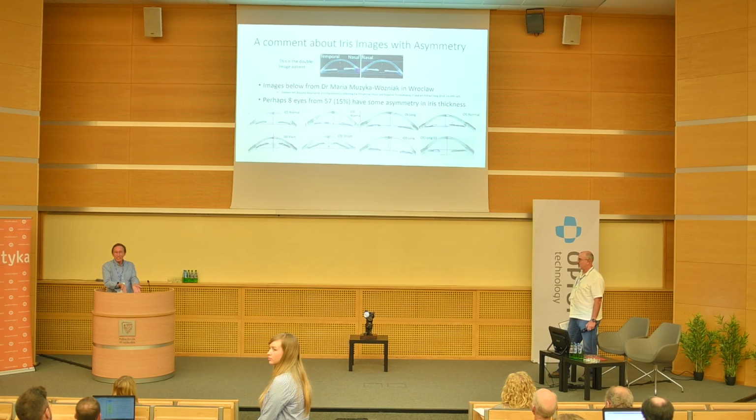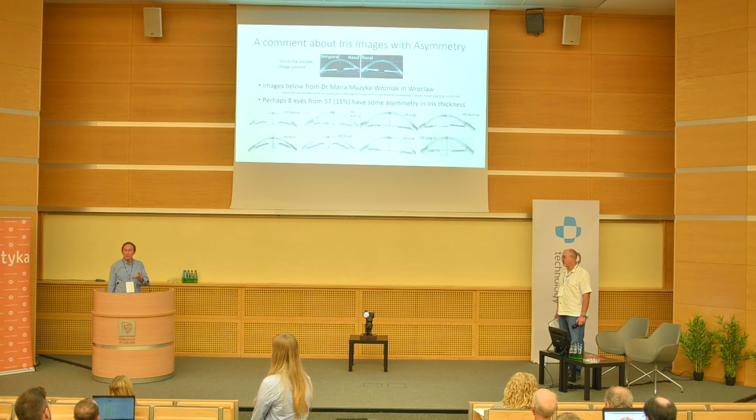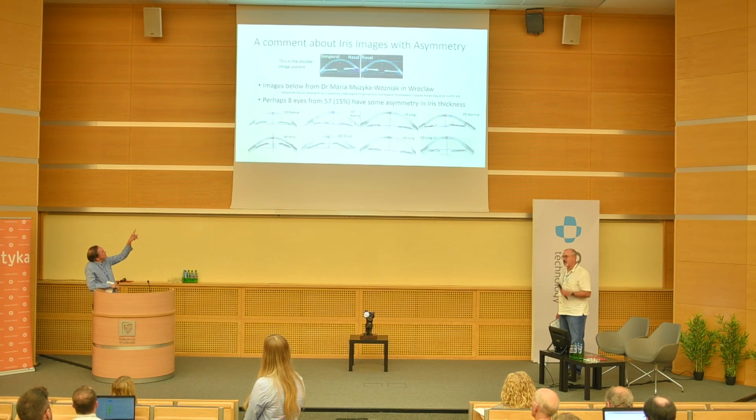I just happen to have these other images that are generally much larger pupils, and you can kind of see it. It just seems like it would be a parameter to track, in case it's indicative of something else. It costs you nothing, in principle. And what do you mean, short normal? Well, this is that paper that's probably referenced there, that Dr.